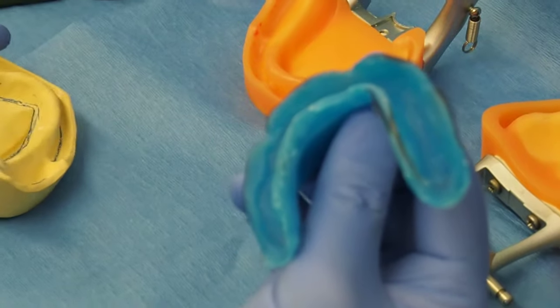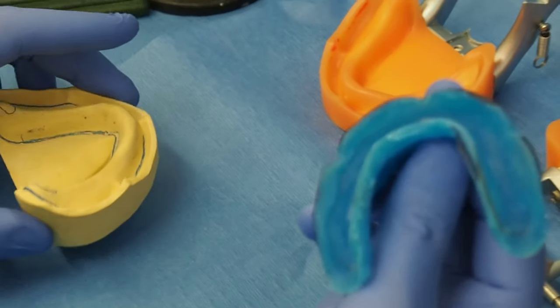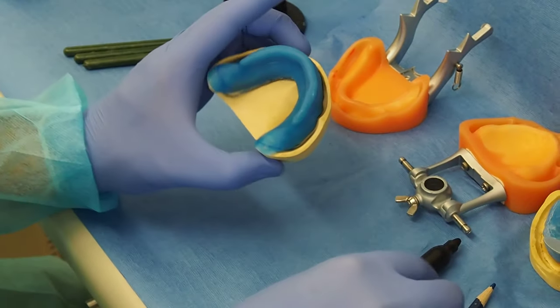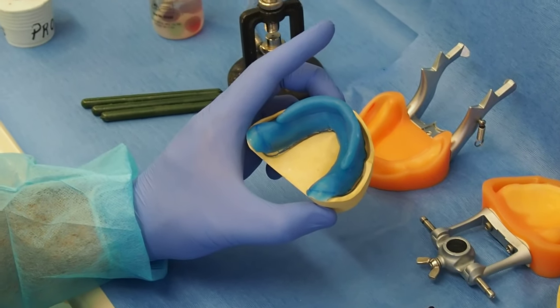So be mindful of that. I'm going to trim this one and then we'll go to the video. I have it nicely marked and then we'll go to the video of border molding.